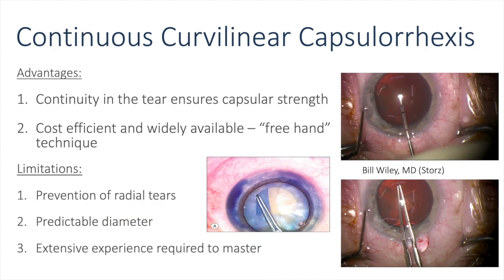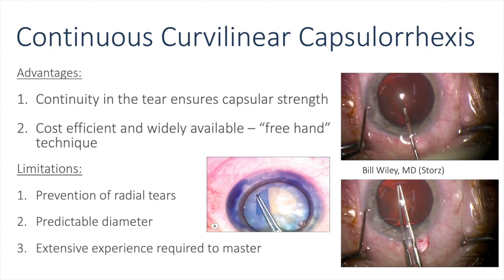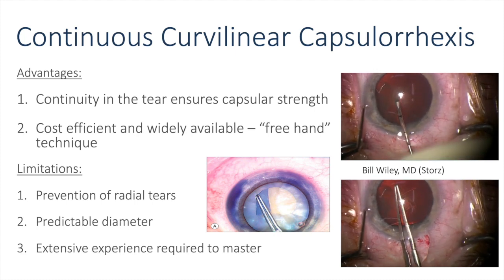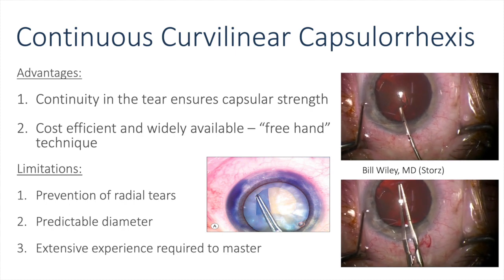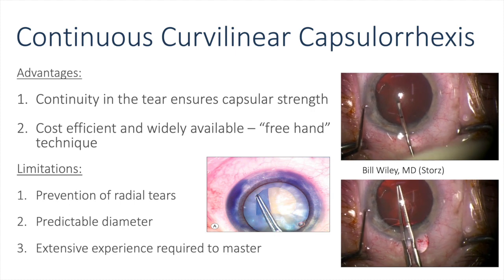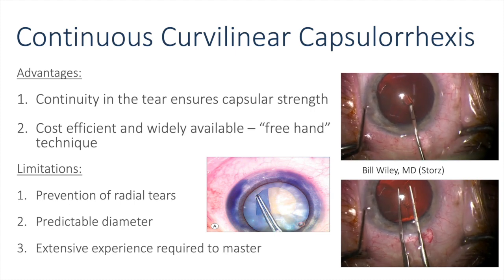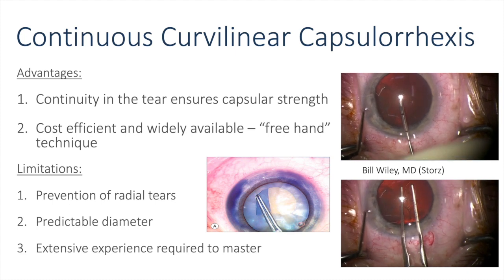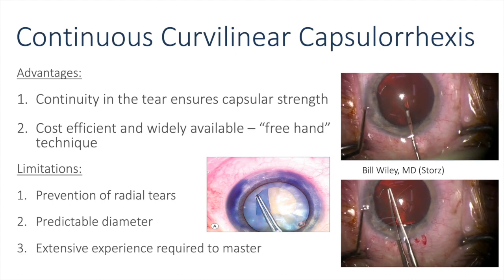The continuous curvilinear capsulorexis has several advantages, including continuity in the tear leading to ensured capsular strength. It is also cost-effective and widely available since it's done freehand. You can see in the upper right-hand side a cystitome used to create the entire continuous curvilinear capsulorexis, while on the bottom right-hand side you see capsulorexis forceps used to achieve the same result.